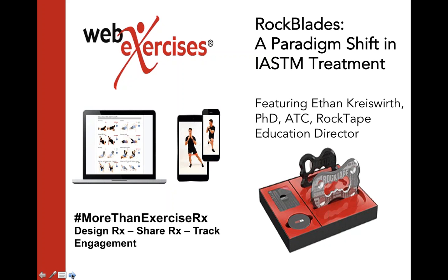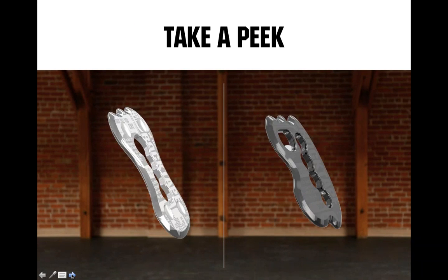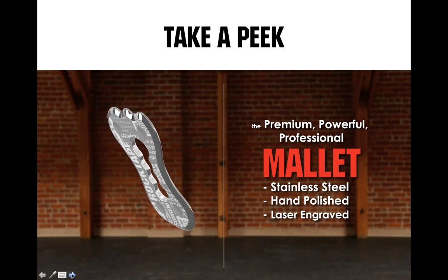So today I really want to talk about instrument-assisted soft tissue mobilization, and that acronym has been out there for quite some time with the advent of tools, whether those tools were gua sha tools, bull bone, or plastic tools, all the way to other types of tools that are now out there. We really want to think about what's going on right now with tooling and manual therapy, and what are we really doing? The research doesn't dive deep into whether there are actual crazy mechanical changes of tissue, compared to what we are potentially doing neurosensory-wise to the nervous system. So we'd like to think about this idea of instrument-assisted neurosensory modulation.